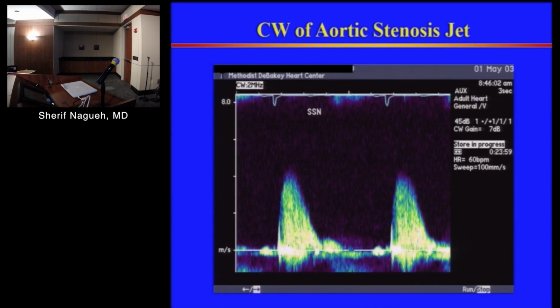through the aortic valve. Remember, what we measure by echo are instantaneous gradients, and these are measurements indeed through the narrowest point of the jet. By cath, they do not get into that narrowest point, and they frequently get a bit ahead of that. That is at a point where there is some recovery of pressure as well. So almost always gradients by echo, peak gradients, are higher than what you get by cath.